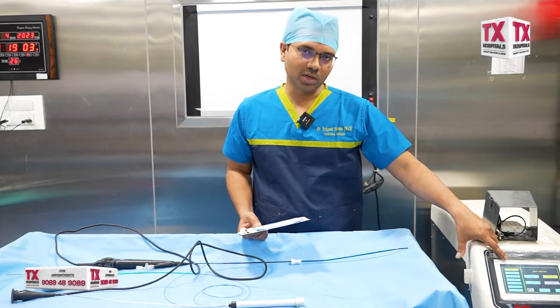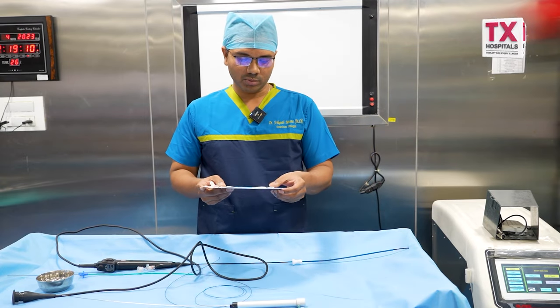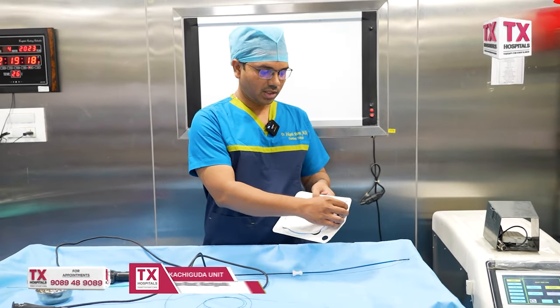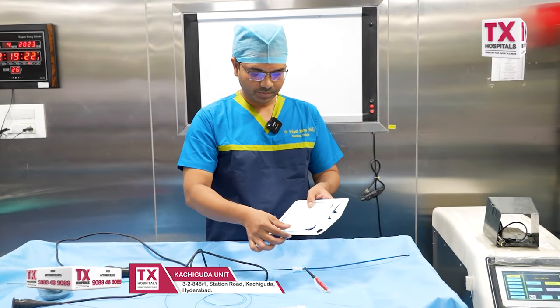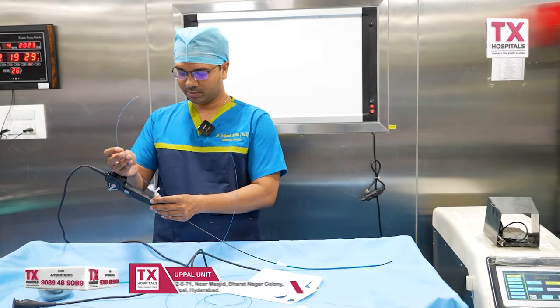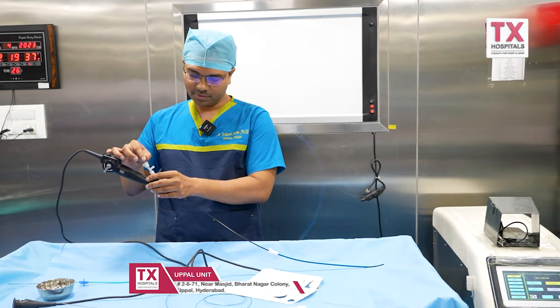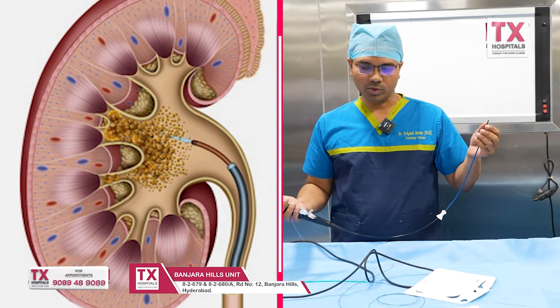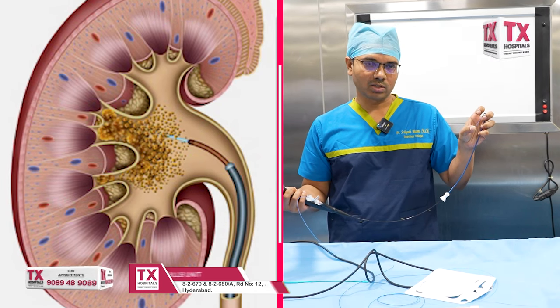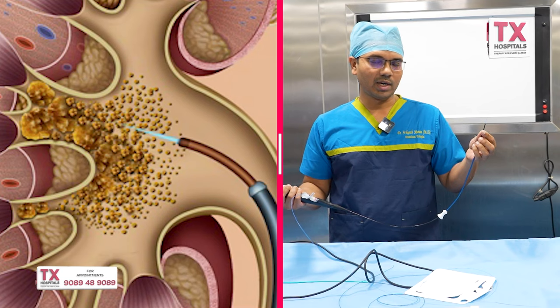We use multiple settings with the RIRS laser fiber. This is the holmium 30W laser. We can use stone dusting or fragmentation — one method is the popcorn method. We connect the laser fiber through the flexible scope channel to the laser machine. At the tip of the stone, we position the laser fiber at about 1mm distance or in contact, depending on where we are breaking it, and we fire the laser. The stone is completely dusted and fragmented.